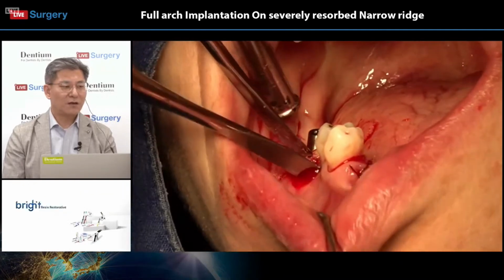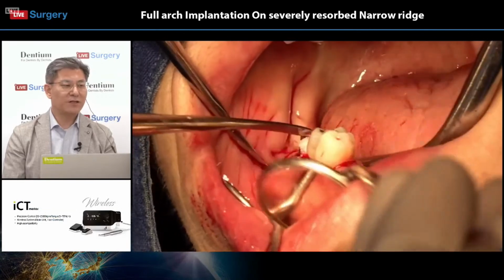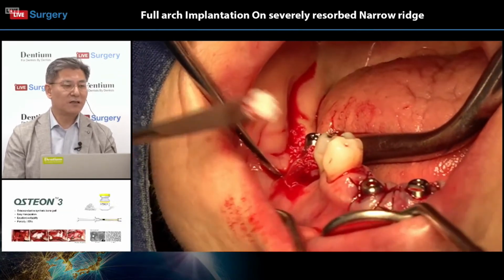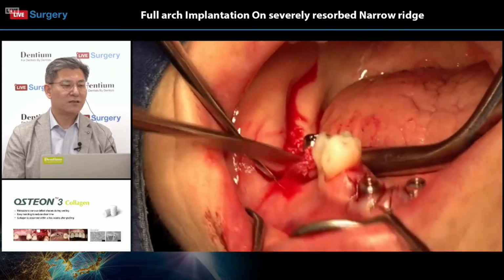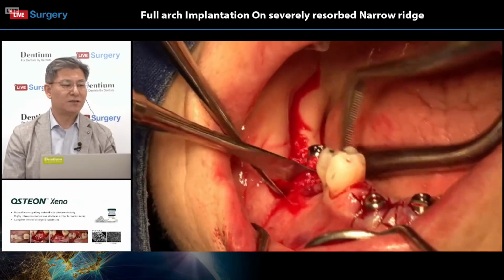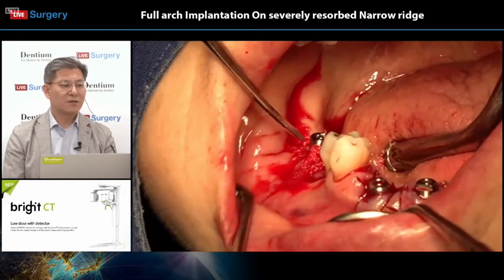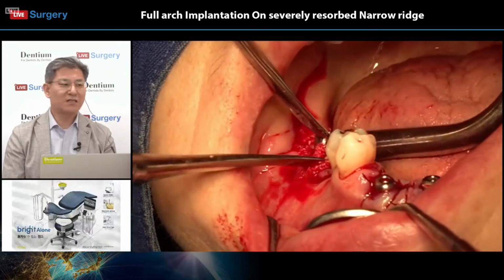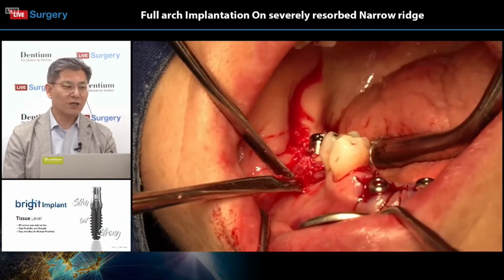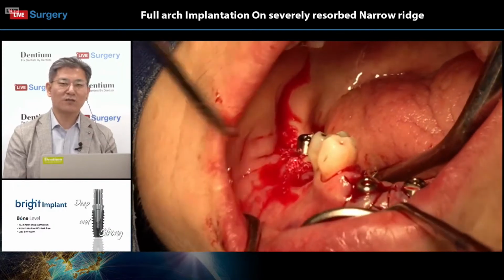Okay, implant first on the number 47 area. And this Osteon xenograft is applied to the socket area. Yeah. So the bone grafting is on the distal root extraction socket, right? The medial root socket has impaction with granulation tissues, so the bone grafting is skipped.